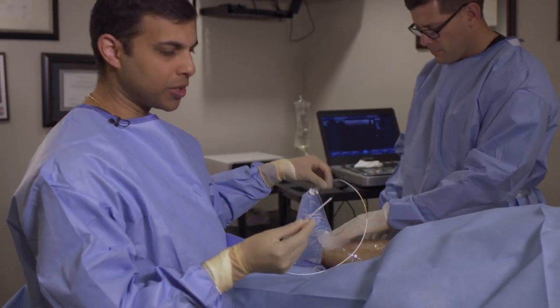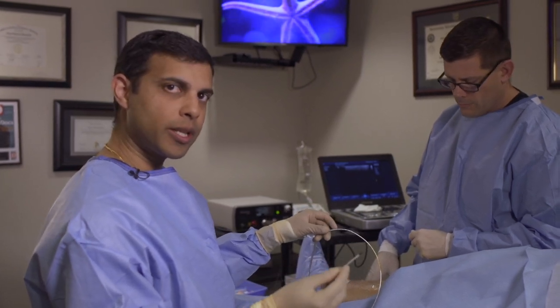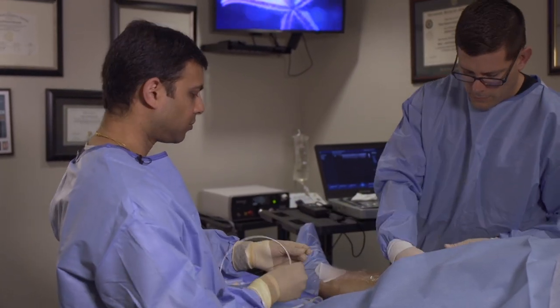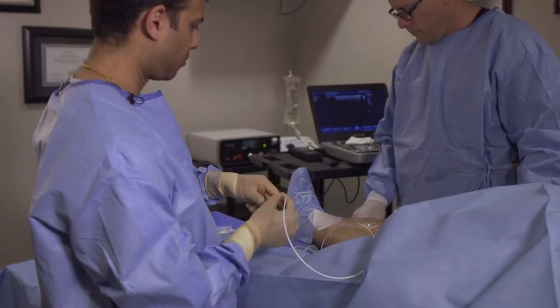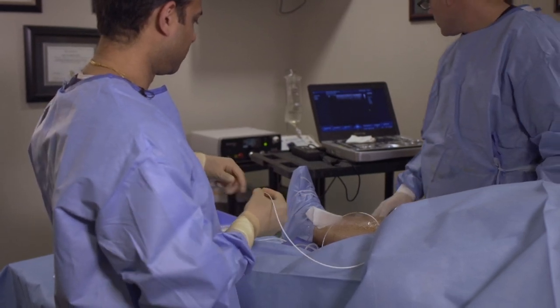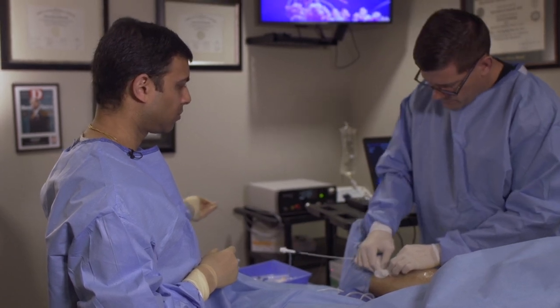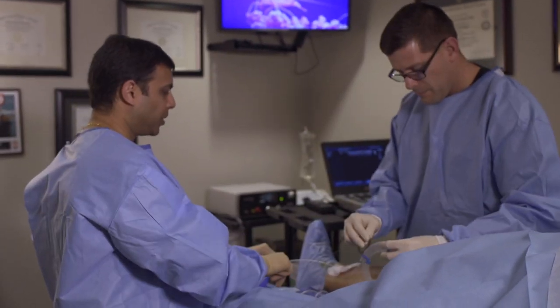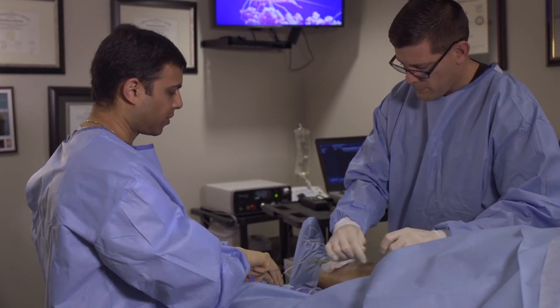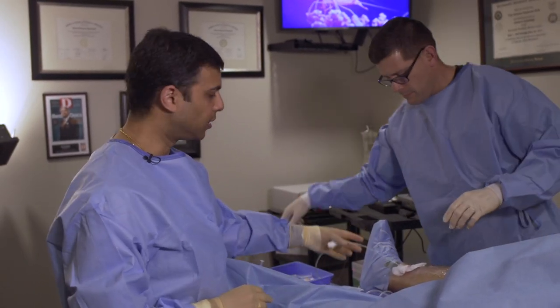Here is the actual catheter through which the laser fiber sits in. This catheter will be placed inside the vein. As you can see, this is the guide wire — you'll see the catheter going up the guide wire. Now we'll go ahead and remove the guide wire, as we no longer need it, so it will come outside the body. All we have left is this catheter entering the vein inside the leg.